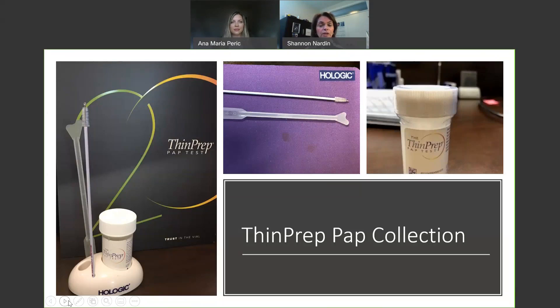Your endocervical brush stays the same, and as I just mentioned, we're moving away from the slide, the mailer, and the spray fixative into a liquid vial, which will give the cells immediate fixation and have a stability of six weeks.